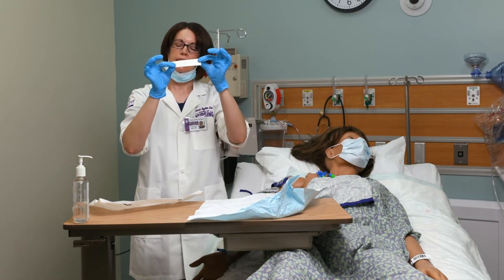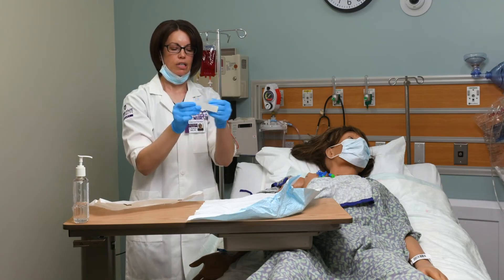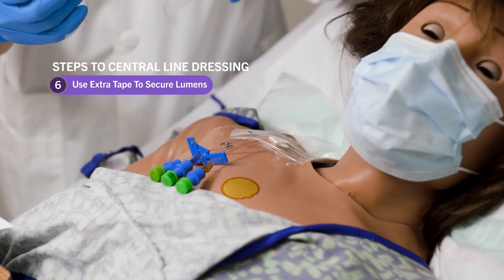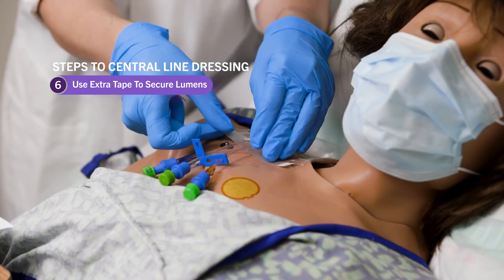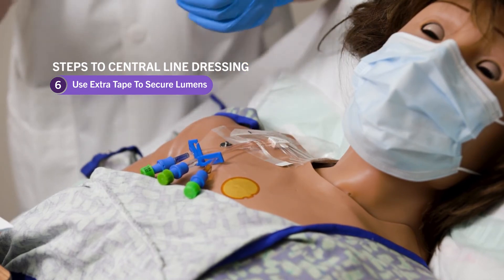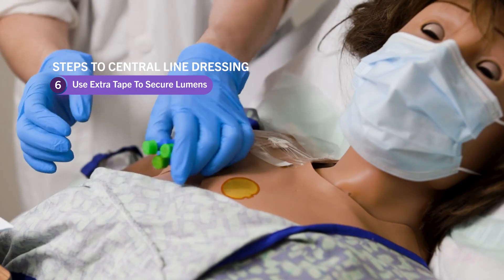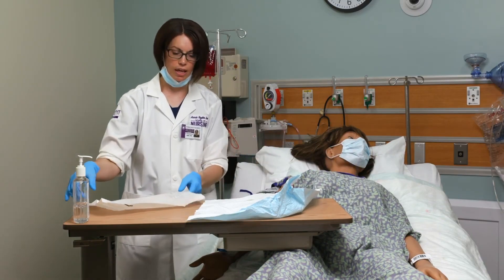There's an extra piece of tape that I'll use to stabilize where the lumens come out of the dressing. I'm going to rip it in half, take one piece and place it right underneath the lumens coming up onto the central line to help secure it down, then take the other piece and go right over the top. That helps secure the lumens and the dressing so it won't come off when the lines are being used. After I'm all done, I make sure to cover the patient back up and clean everything up from the procedure.